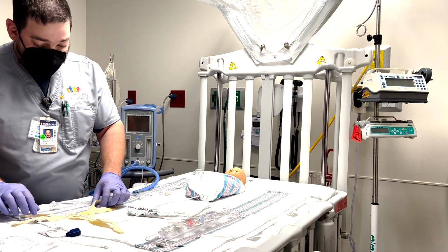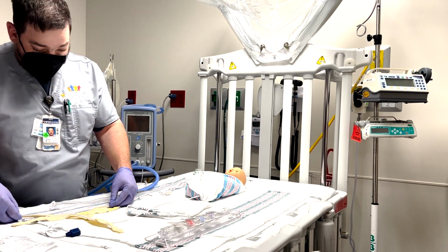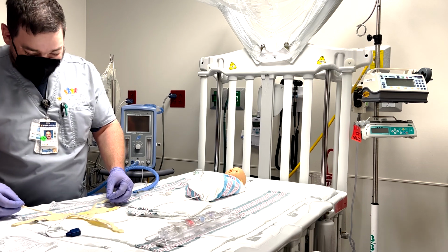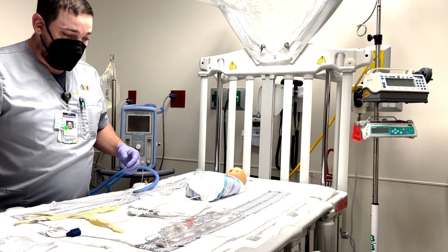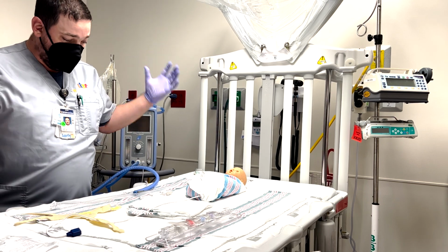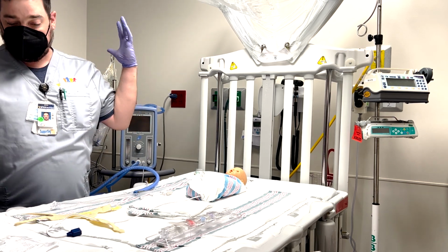And if that therapist needs help, they'll call another therapist. But this is important. Okay. So the kid's chugging away. You've called the attending. You've called the therapist. The attending and the therapist have agreed we need to put this baby on CPAP.